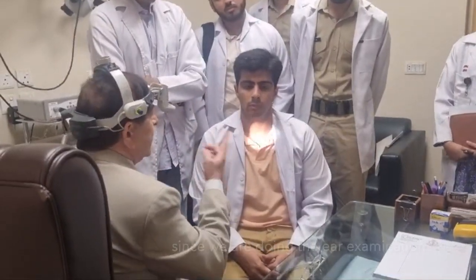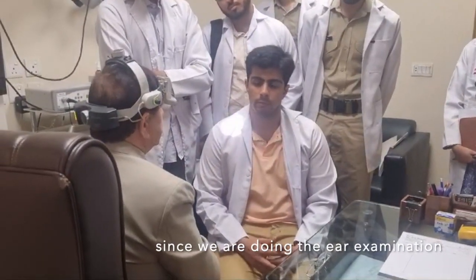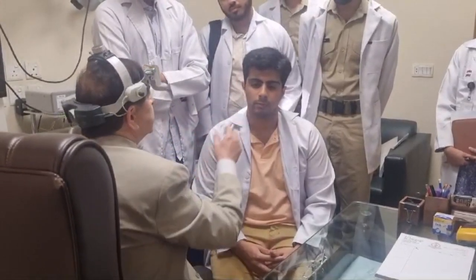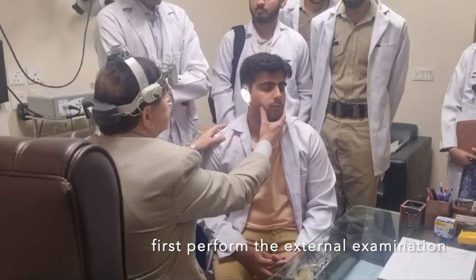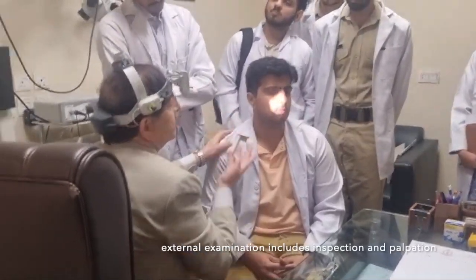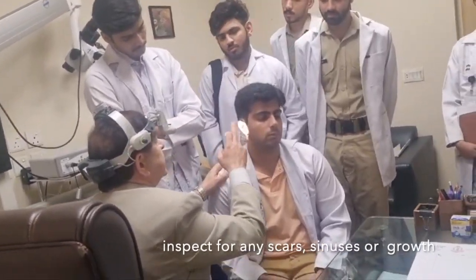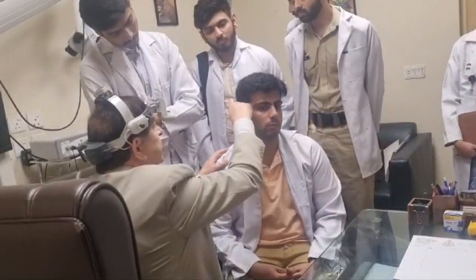Since we are doing the ear examination, the next step comes. First is the external examination. External examination means we use two techniques: inspection and palpation. So just put the light, see, and look for any scar, sinuses, or growth in the front.